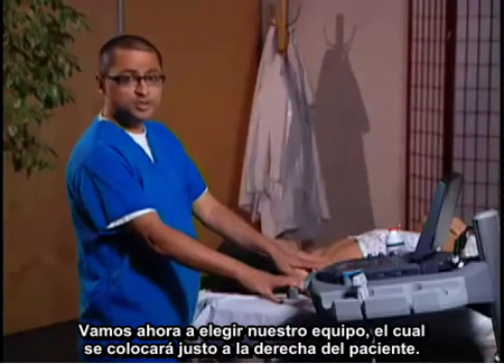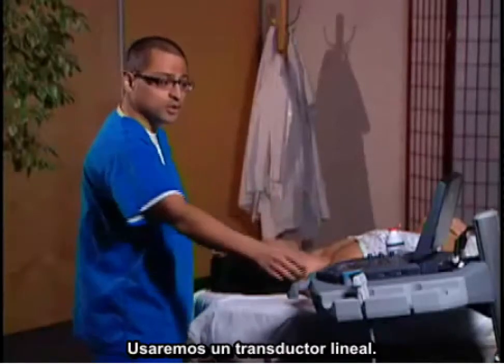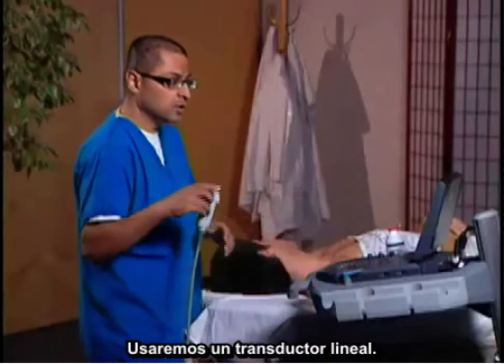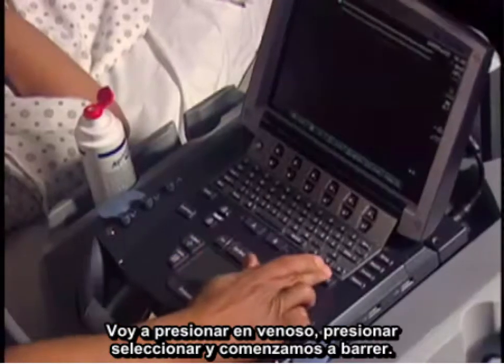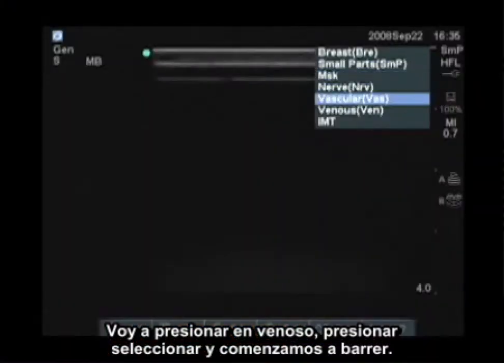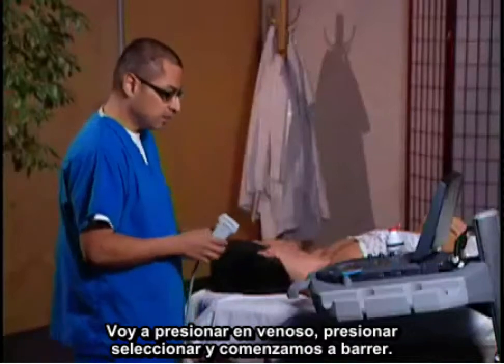We're going to go ahead and choose our system, which is going to be placed just to the right of the patient. We're going to use a linear A transducer. We're going to go ahead and set up our examination type. I'm going to hit exam. I'm going to click on venous, select, and we're going to be ready to start scanning.